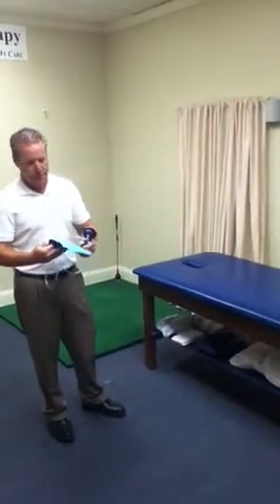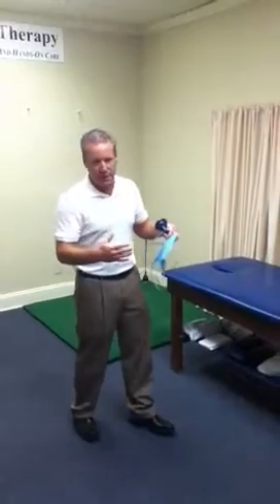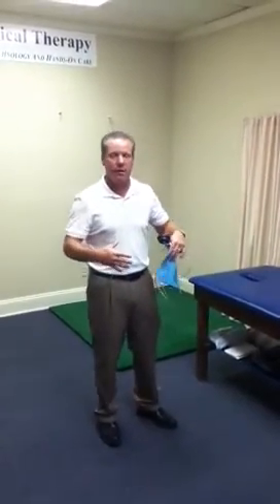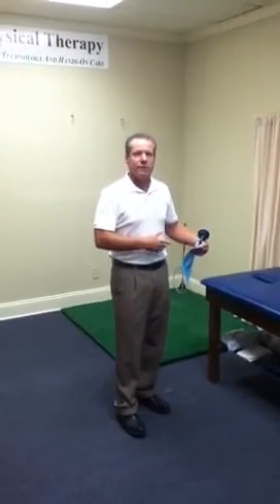This is a device that we're going to use to train the core. Basically, in any functional exercise program, we want to make sure that we start with the core. It's kind of like building a house — you'd start with the foundation. We're going to start with the core by targeting the abdominal muscles, specifically the transverse abdominus muscles.